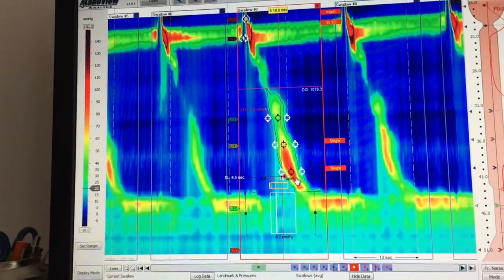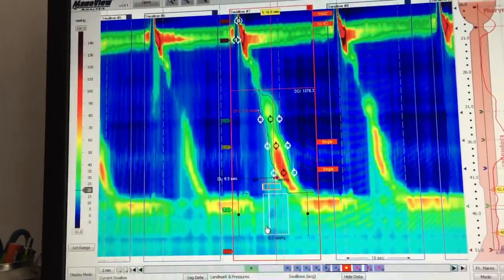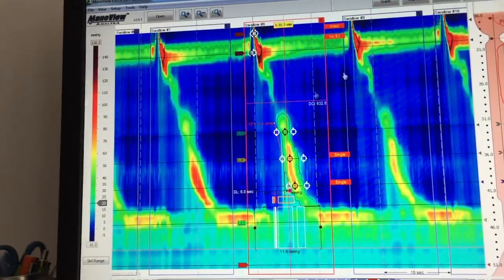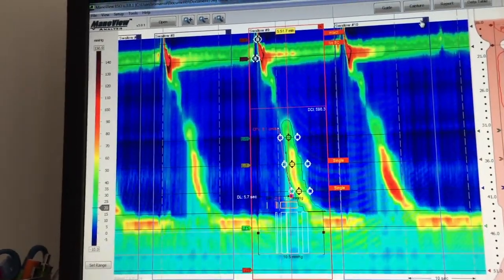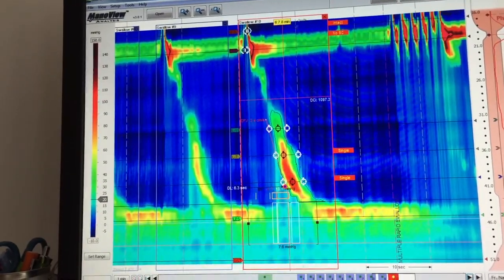This one is intact: the DCI is normal, distal latency is normal, the IRP is normal. Going to the next one — normal swallow again. Normal swallow. And the last one is also a normal swallow.